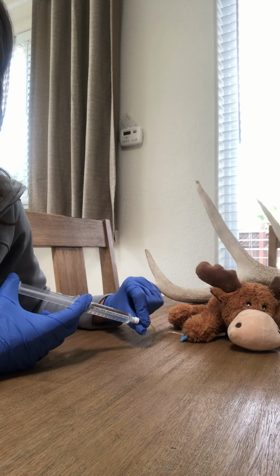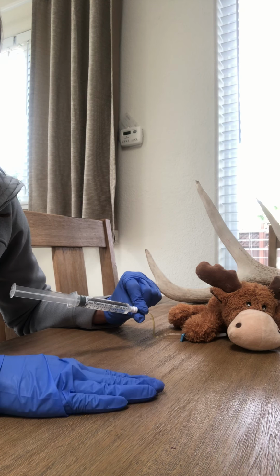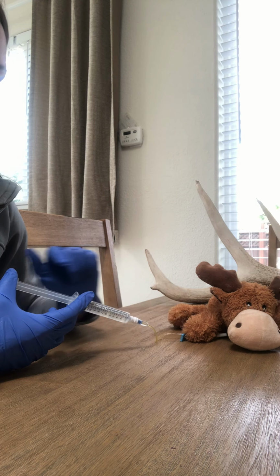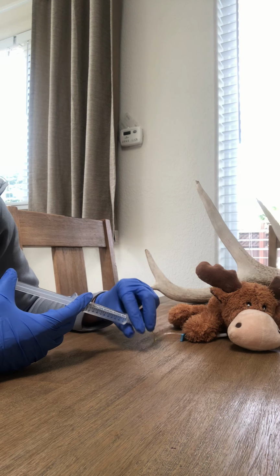3 mLs. I realize I just said 5 mLs in the beginning. I would flush to start with 3 mLs, and then I would flush after the medication with 1 mL to clear the line at the same rate, and then 5 mLs to clear out the rest.